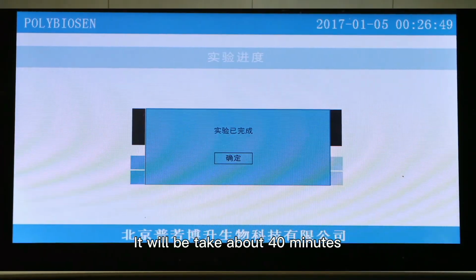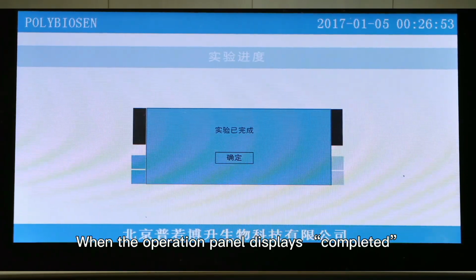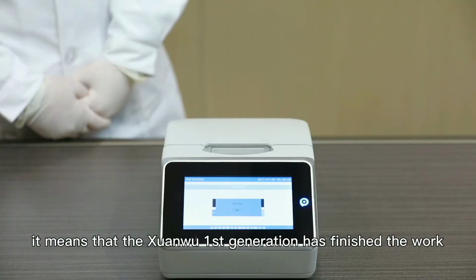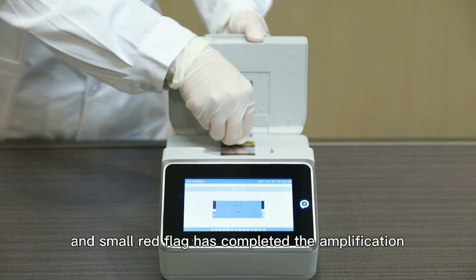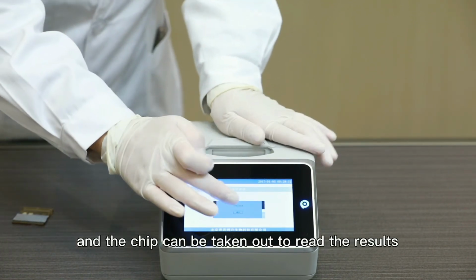After about 40 minutes, when the operation panel displays that the experiment is completed, it means that the Xuanwu first generation has completed the work, and the small red flag has completed the amplification, and the chip can be taken out to read the result.